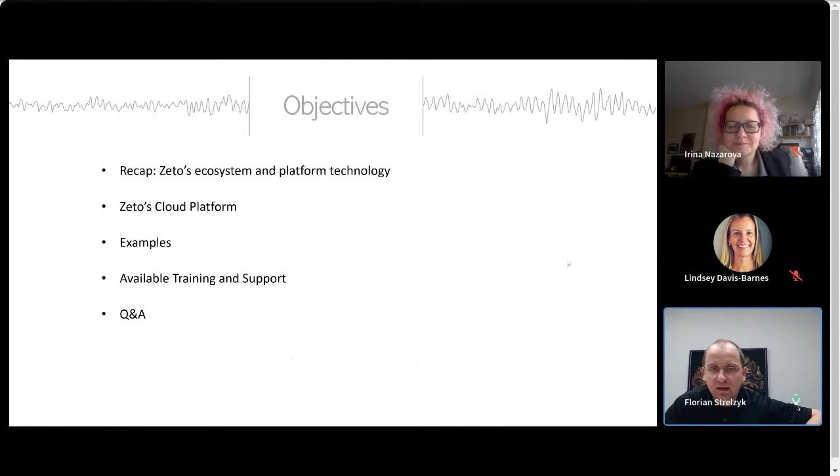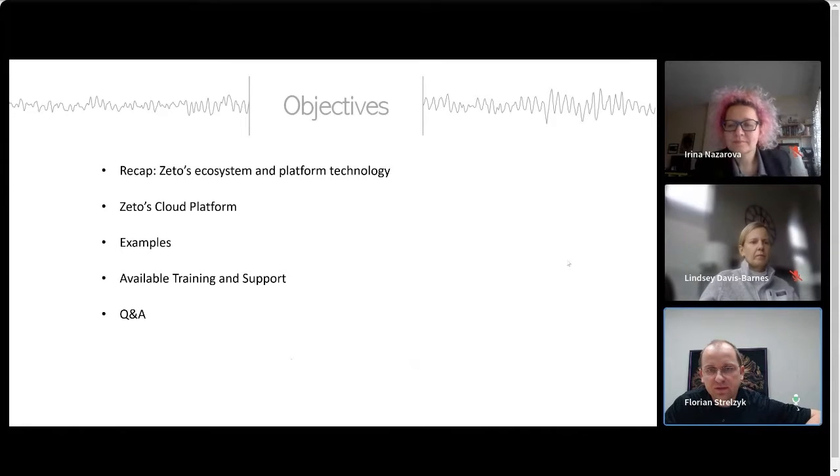So today we're going to talk a little bit about the ecosystem and the Zeto platform technology. I'll go over examples, and at the end, we'll talk a little bit about training and support in case you are a Zeto user, what's available for you. Also, at the end, we of course have Q&A.